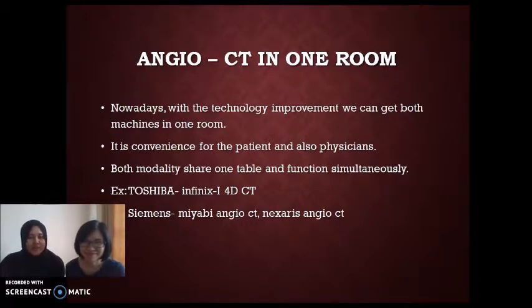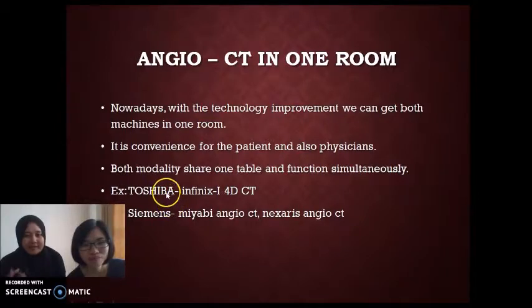Shares one table only. Two machines, CT scan and angiography, but use only one table. I will show you the video later. But I want to tell you that there are two companies that provide this hybrid imaging, angio and CT, which are Toshiba and Siemens.